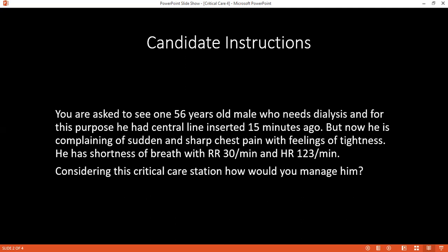Can you please tell me the technique, according to the NHS guidelines, for the insertion of a central line? Seldinger technique. The technique is to identify the landmark, which is the mastoid process and the two ends of the sternocleidomastoid muscle, a depression.